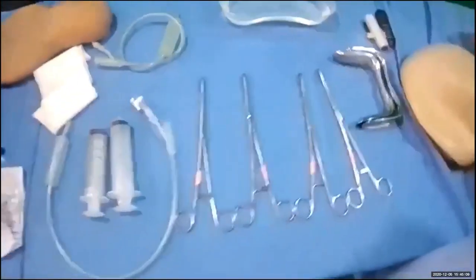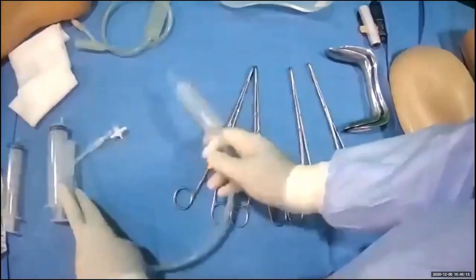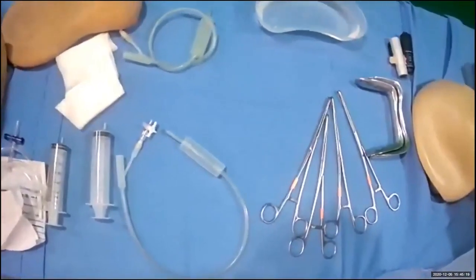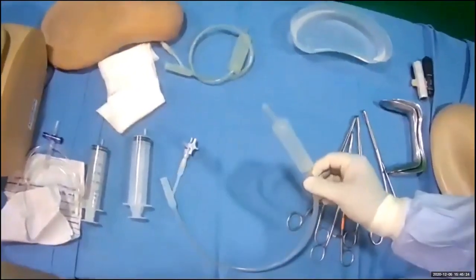How to perform a uterine balloon tamponade. There are numerous uterine balloons available. You can use a condom catheter, you can use a Foley's catheter, but we also have the option of using a Bakri balloon.